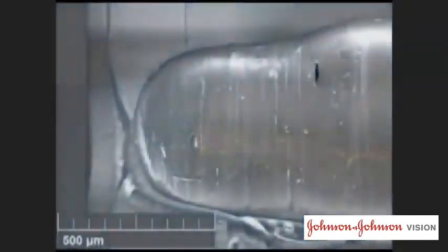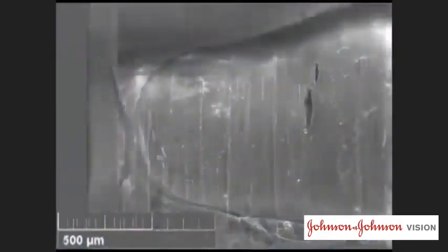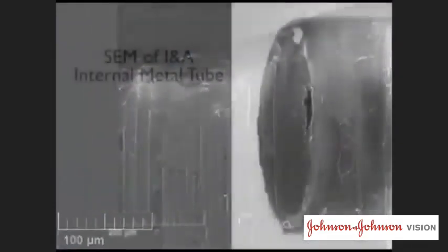The tip that caused a PCR when the aspiration port was turned up revealed a tiny defect in the silicone sleeve opposite the aspiration port. Scanning electron microscopy shows a 50 micron tear in the silicone sleeve.